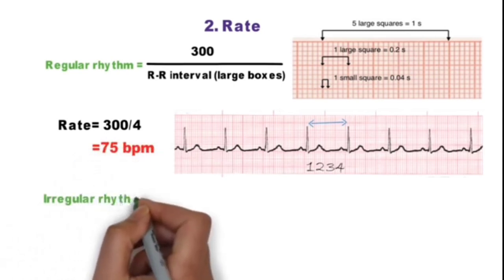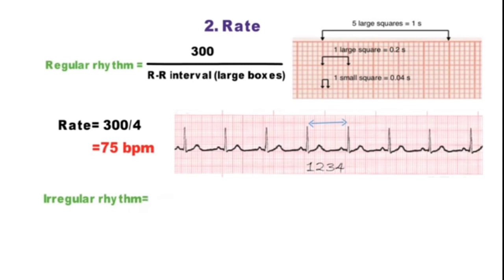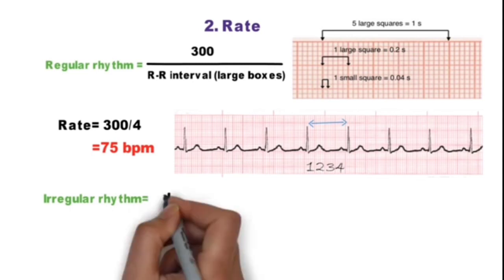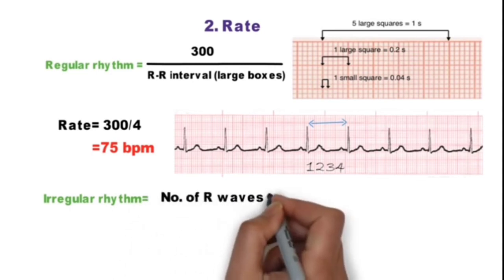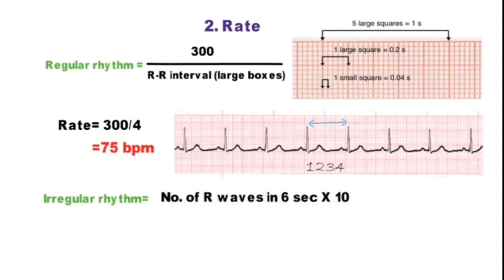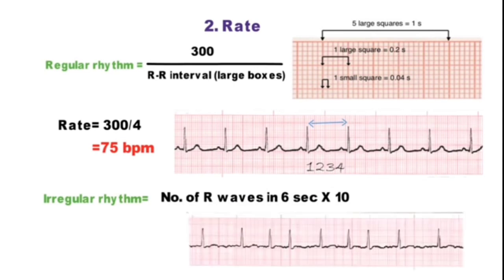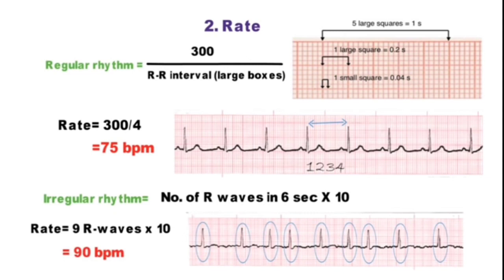But if the rhythm is irregular, as in atrial fibrillation, rate is calculated by number of R waves in 6 seconds multiplied by 10. In this ECG strip there are 9 R waves, so rate comes out to be 90 beats per minute.